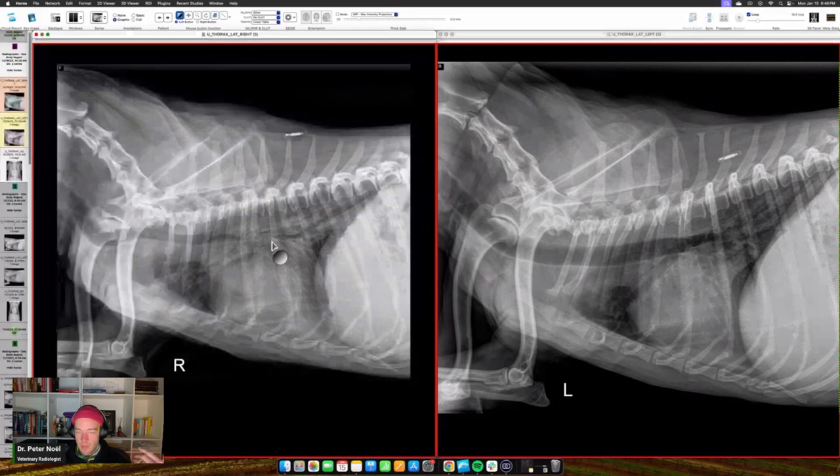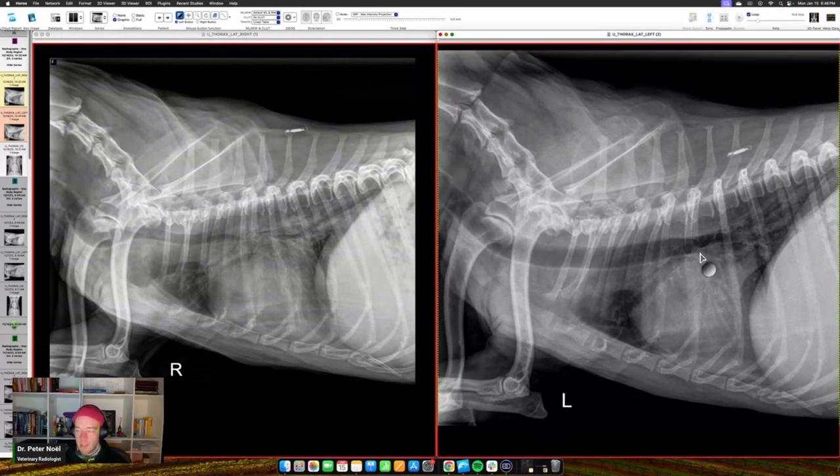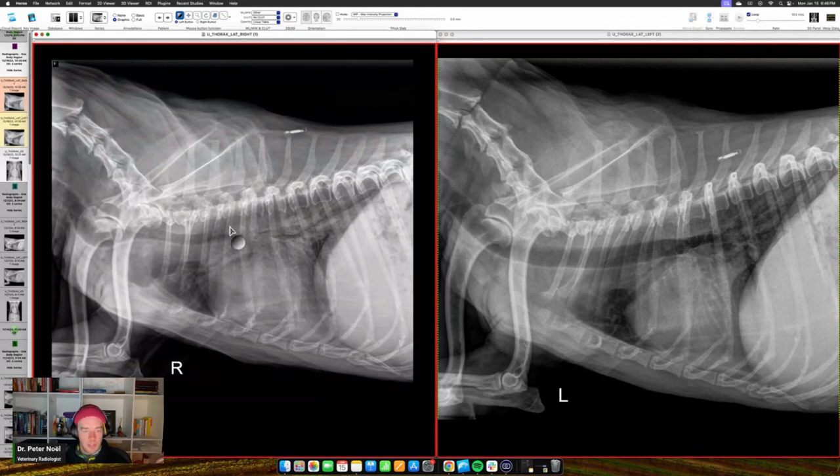And at least when I was in training, you really needed to be aware of the bronchial component because of the inability to stent those. I think somebody recently tried it or whatever, but I don't know. So you can stent the trachea, but those bronchi are not. So that's the first thing. The second thing is when you have an expiratory radiograph, this next point I think is so critical. When you look at this radiograph, you should say to yourself, holy smokes, there's something up here.